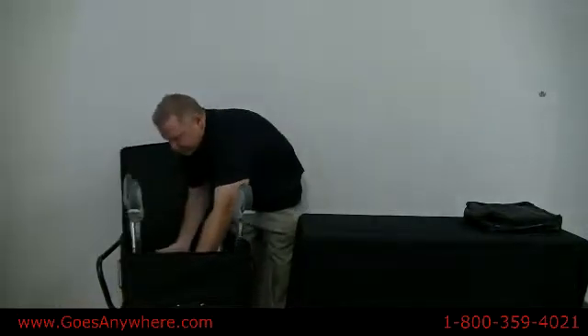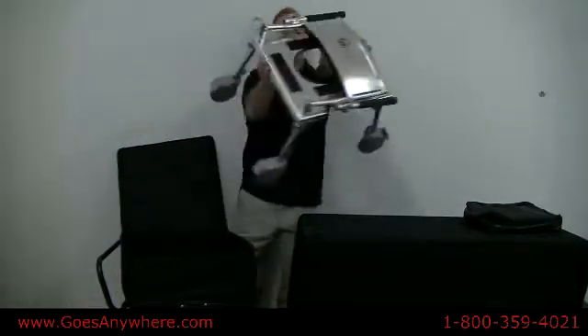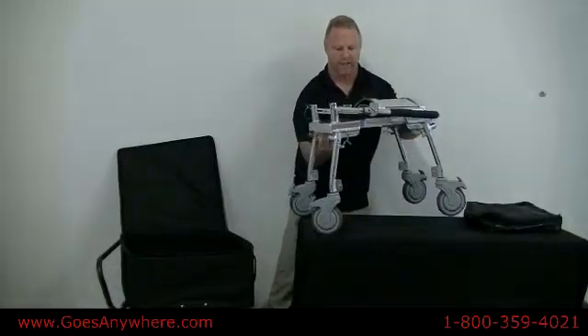When removing the frame from the travel case, make sure you grab the seat frame, lift it up and place it straight onto a flat surface — normally the floor; in this case I'm using an elevated table.